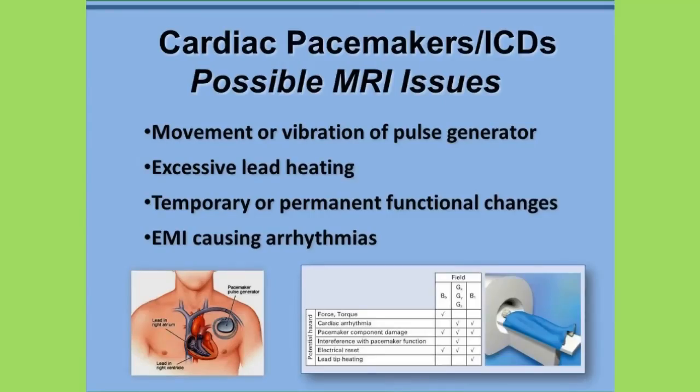Now let's take a look at other important active implants, cardiac devices. There are several possible MRI issues that exist for these implants. For example, patients with standard cardiac pacemakers or ICDs may experience serious problems in association with MRI exams due to a variety of factors, including possible movement or rapid vibration of the pulse generator, excessive heating of the leads, temporary or permanent modification of the function of the device, and electromagnetic interference, or EMI, causing unwanted stimulation or arrhythmias.